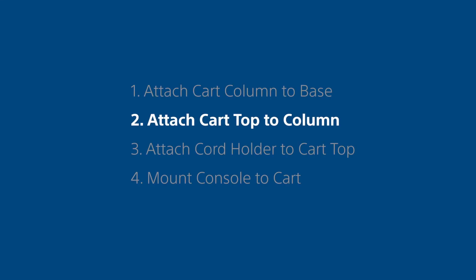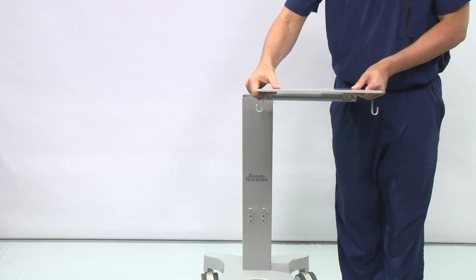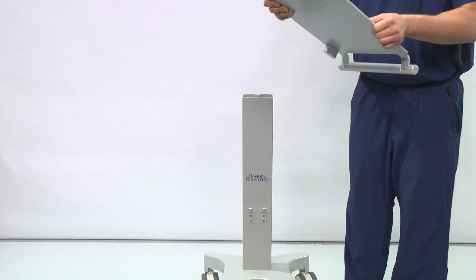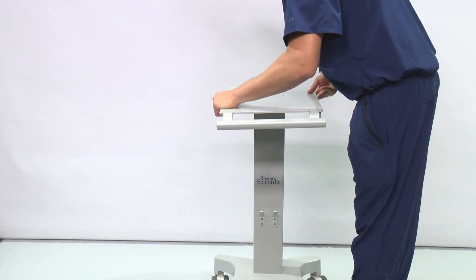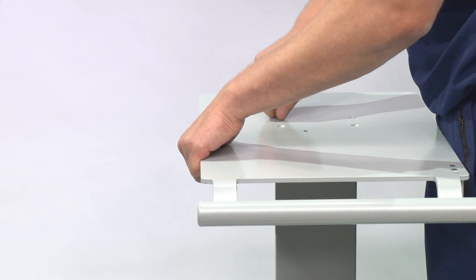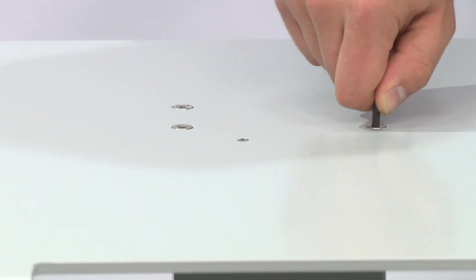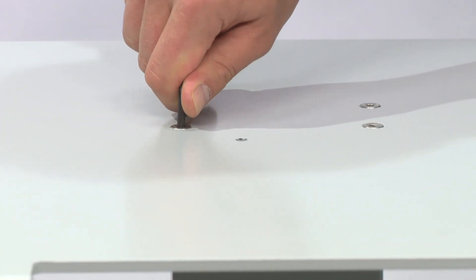Step 2: Attach the cart top to the column. Make sure you have the small screws and the allen key close by. Turn the cart right side up and position the top so that the hooks are underneath and the handle is at the front of the cart. Screw the cart top onto the column using the allen key. Make sure the screws are fully tightened.